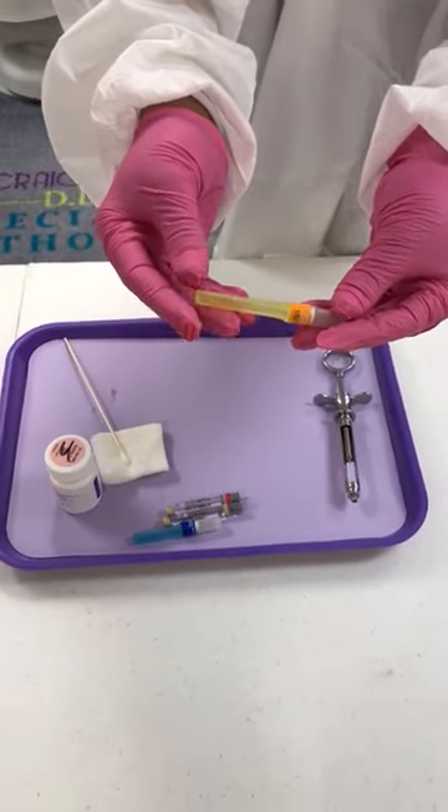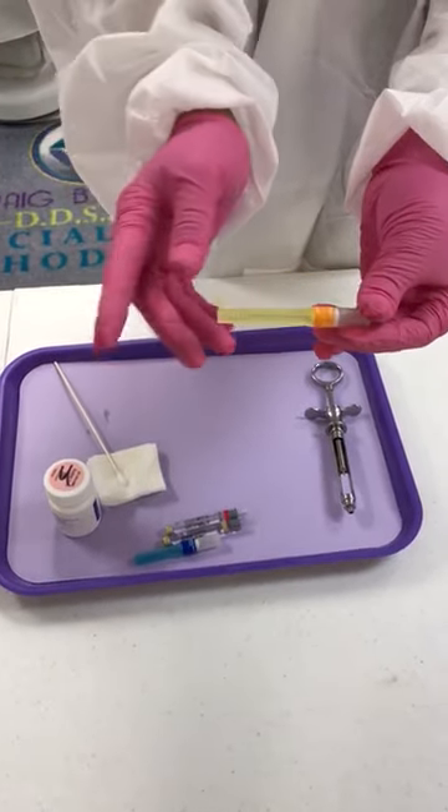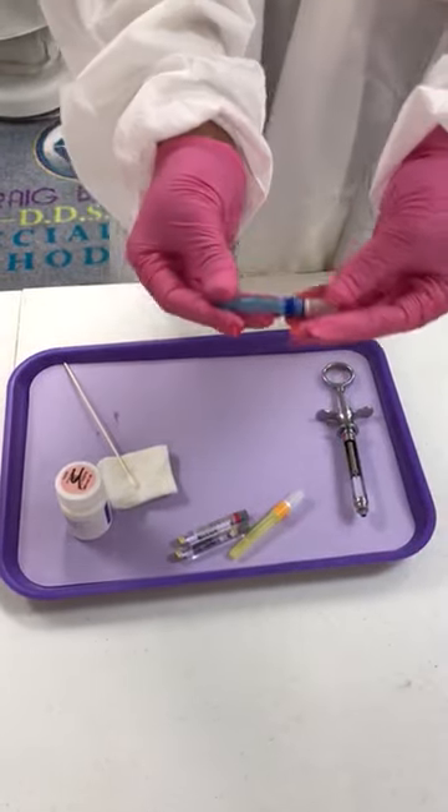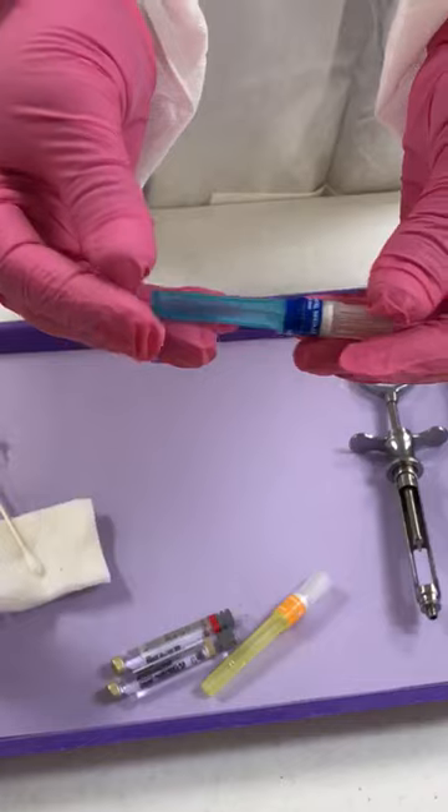When you are in the posterior part of the mouth, the long needle is what they use for that. Now the short needle here, which is the blue needle, is for the anterior part of the mouth when you work with anterior teeth.